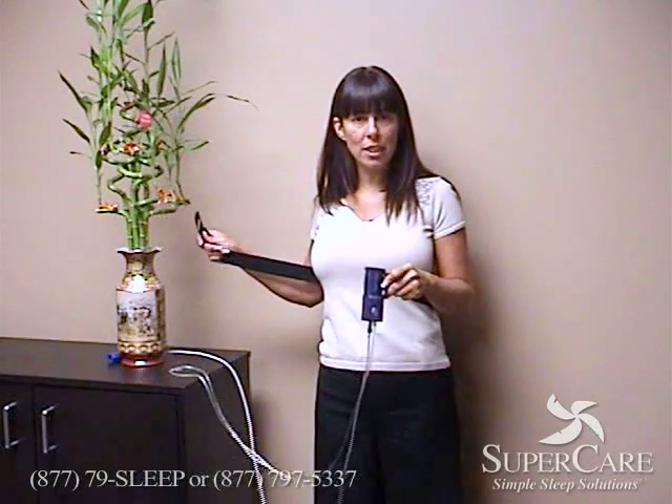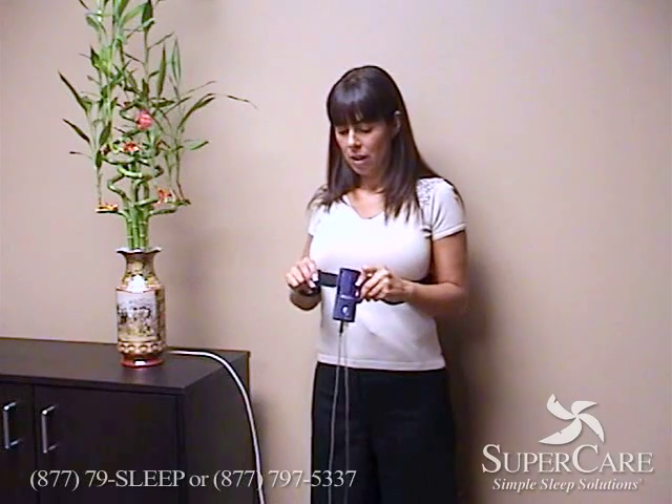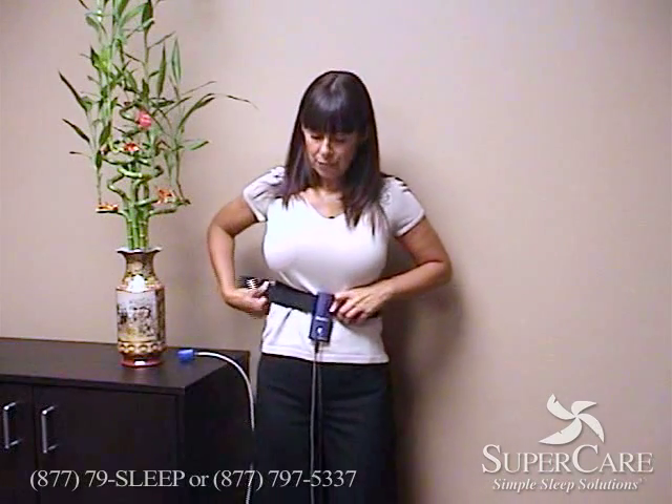Once you have everything attached to the apnea link, go ahead and strap the belt onto one side. You can either put this around your chest or around your midsection, wherever you're the most comfortable. Go ahead and slip the other part of the belt to the other side and affix it like that.